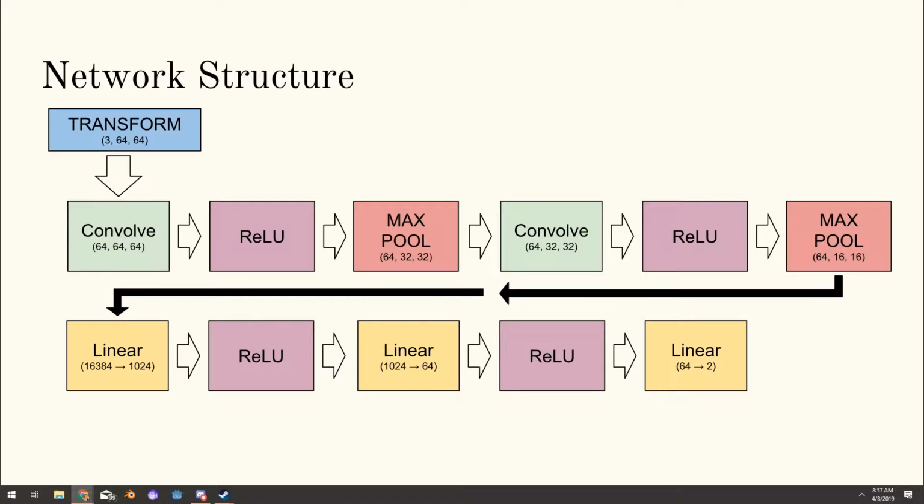a learning rate of 0.002, and I used 25 epochs, however, I stopped seeing improvements after around 10 epochs. The network would save itself every time it would score a new high on the validation set.